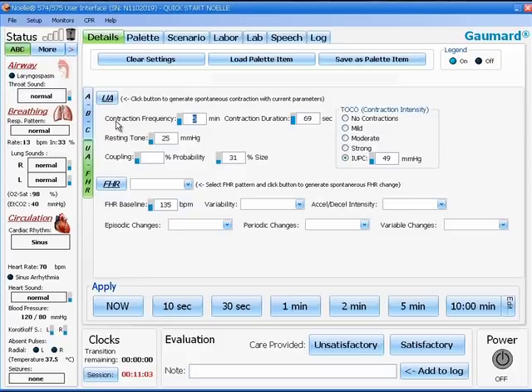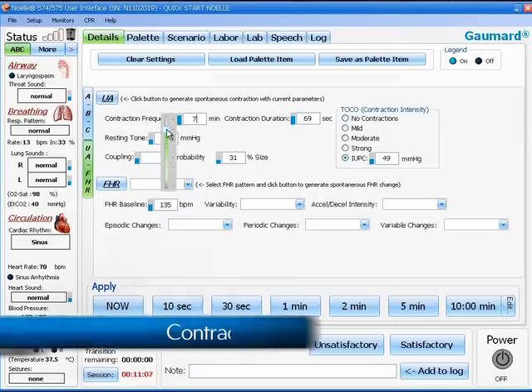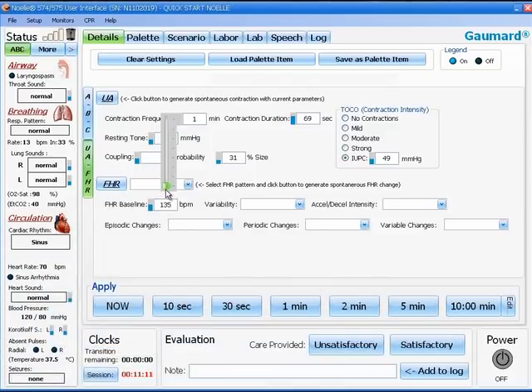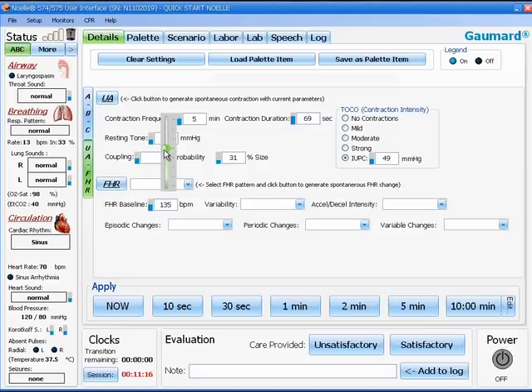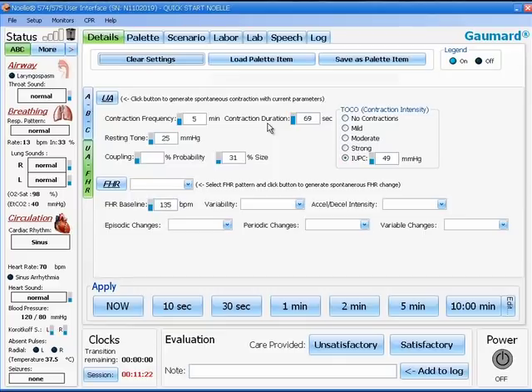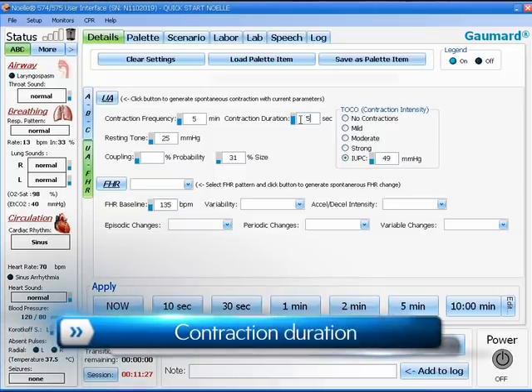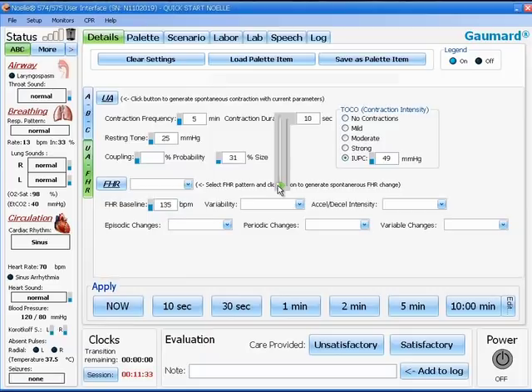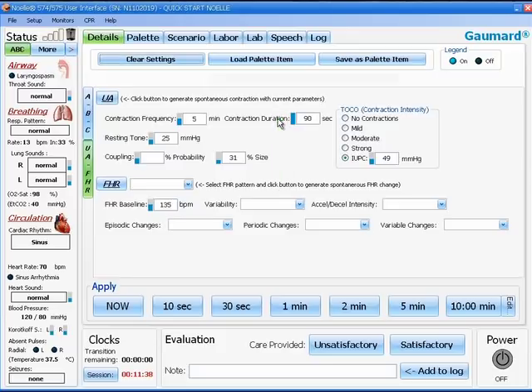Starting from left to right at the top, the first box of parameters is called contraction frequency. You can set this by dialing in a numeric value or using a slide bar to the left of the box. The allowable range is from one minute to eight minutes. The next box over is the contraction duration. This can also be set with a numeric value or using the slide bar to the left. The limits for the contraction duration are 10 seconds to 90 seconds.